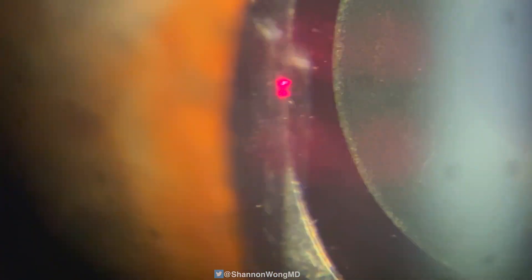For this patient, we apply 12 pulses at 7 millijoules per pulse to create a circle around the opaque ring inside the lens implant, which is six millimeters in diameter. Our objective is to clear the central aperture of the eye without applying laser spots through the 1.36 millimeter central aperture.